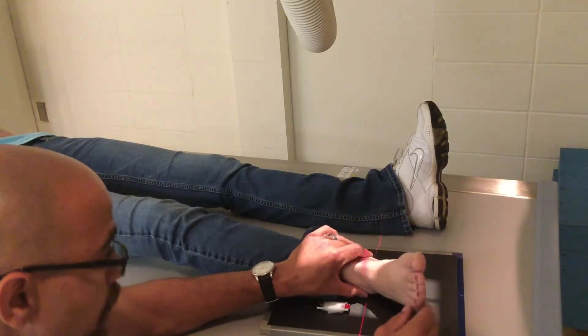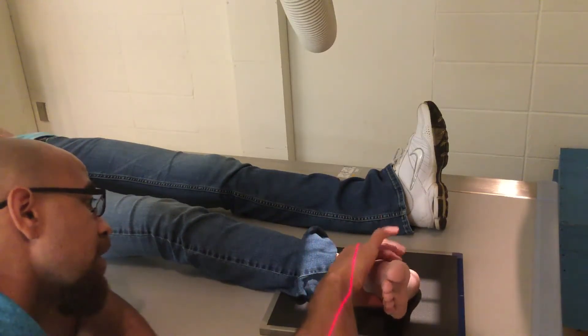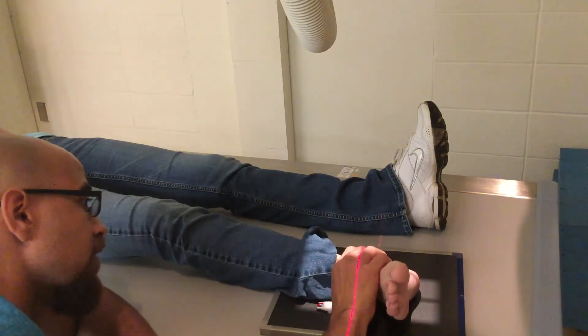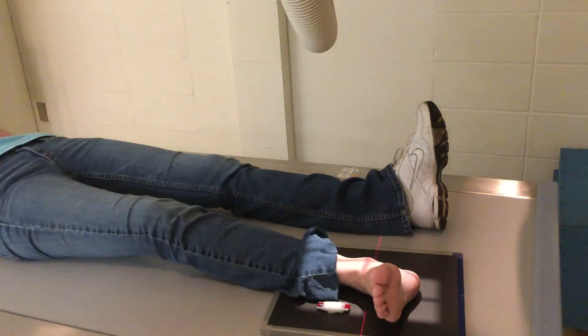So you raise the foot slightly, pull the toes up, and you can feel the malleoli — when they're on top of each other, just roll like that to get it right. Pull the toes up. Don't flip the heel. Center up on the medial malleoli. That's your ankle series.